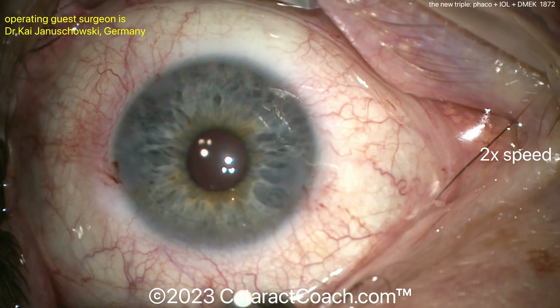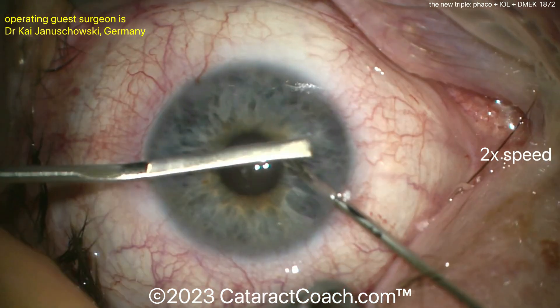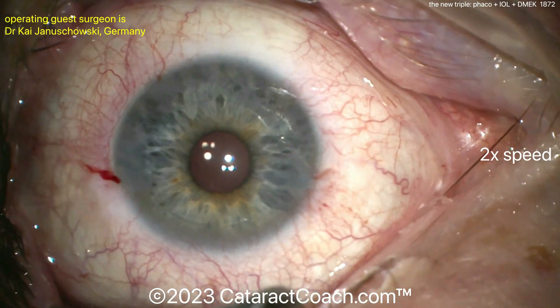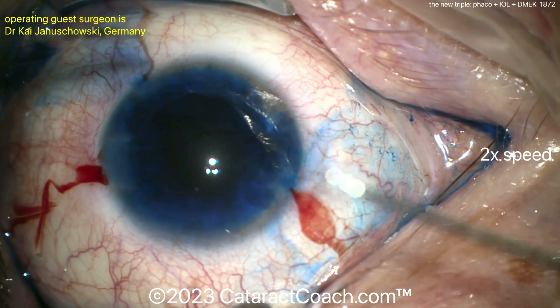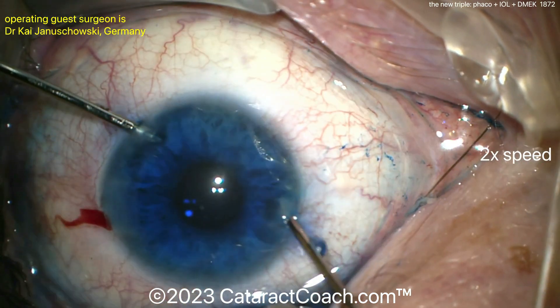There's a single 360-degree swoop with the inverted Sinski. And then now it looks like a scraper, going around and scraping that off. Wow, that was efficient.